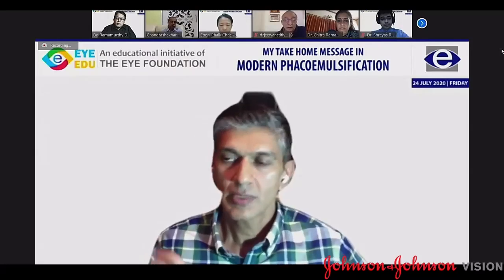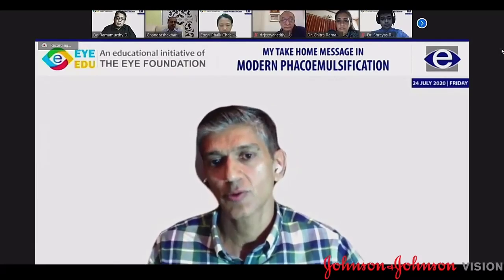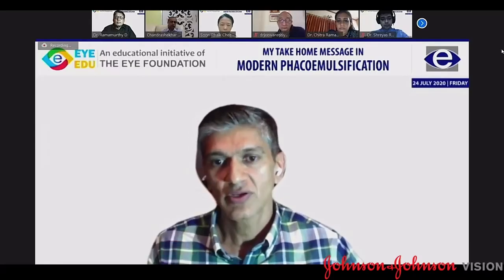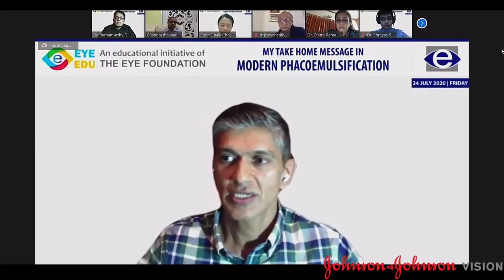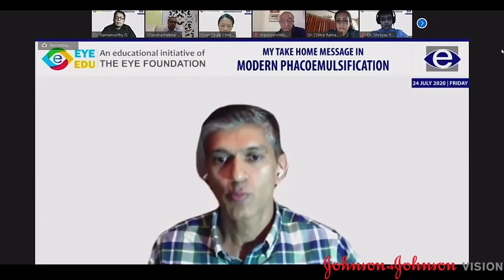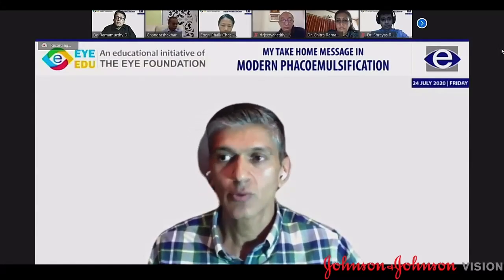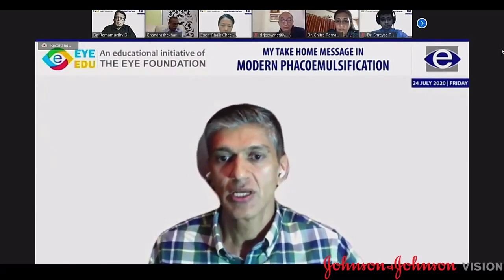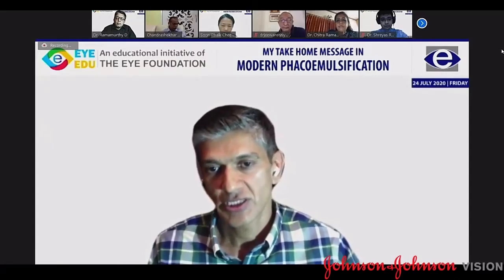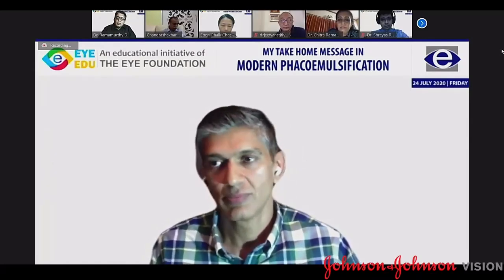That is one point. The other point is that post-op refraction is very important to assess. It's very important to do a thorough post-op refraction, and you have to refract to best corrected visual acuity, because what most operators do is they just see 6/6 and say the patient is fine and send them off. But you have to refract to best corrected vision, refract to 0.25, and then put in the readings. We also like to do a post-op biometry and enter the data, because now you have the EQ workplace. If you do the post-op biometry and enter the refraction, it also looks at effective lens position, whether there's any change, and then it further refines your biometry. So these are a few points I wanted to make.